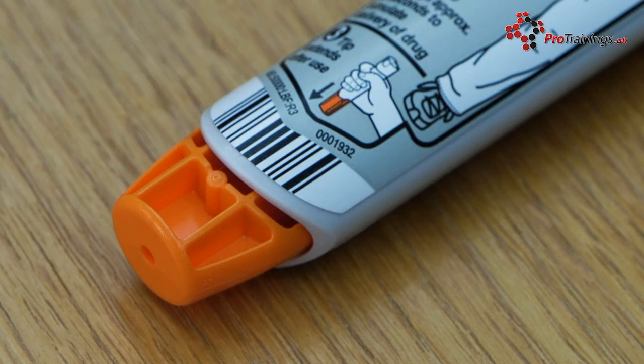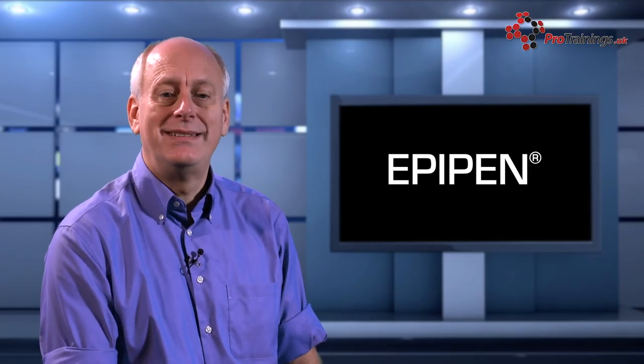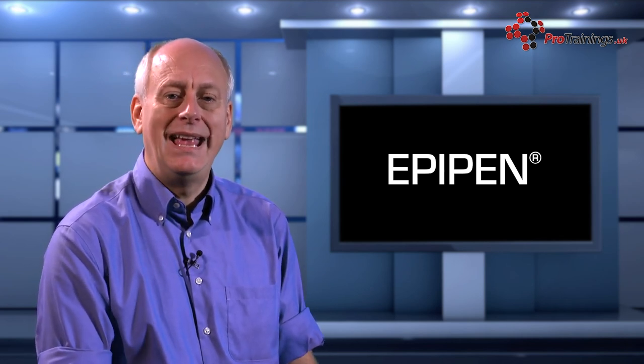When the EpiPen has been used, a needle cover will appear automatically over the needle to prevent any further needle injuries. The used EpiPen should be given to the emergency services after use so they can see exactly what has been administered to the patient, and they can also dispose of it correctly. Should a second dose be required, repeat the process and make sure again that you give both pens to the emergency services.